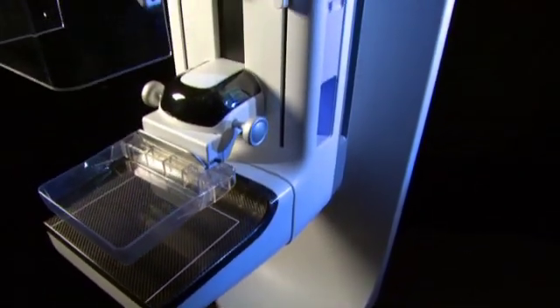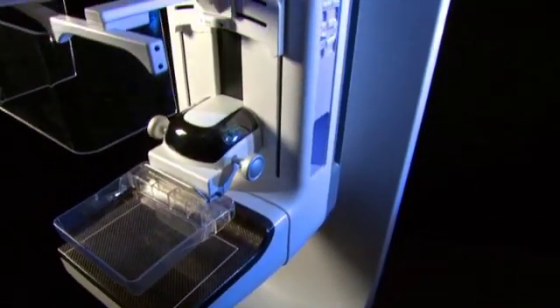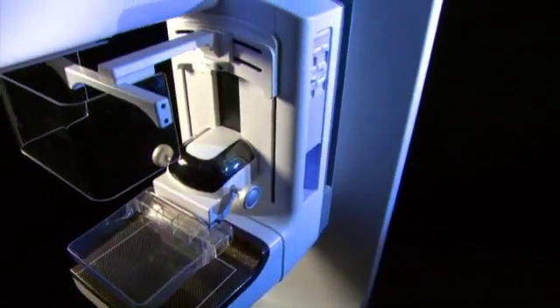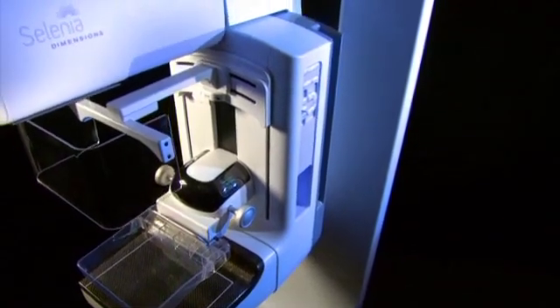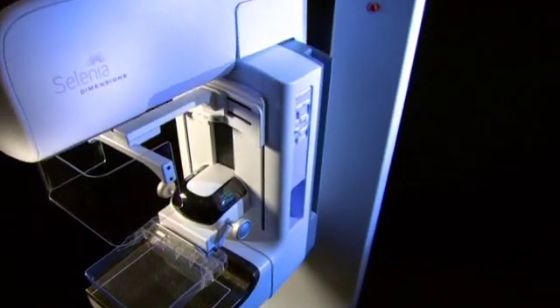Selenia Dimensions, a revolutionary new tool in the fight against breast cancer.